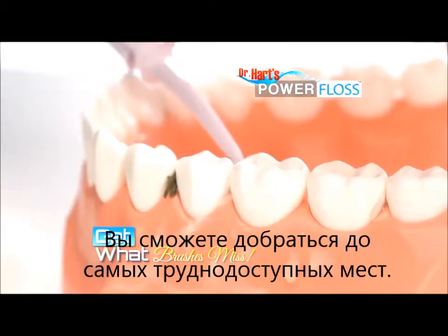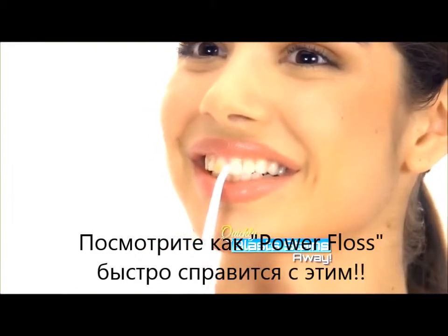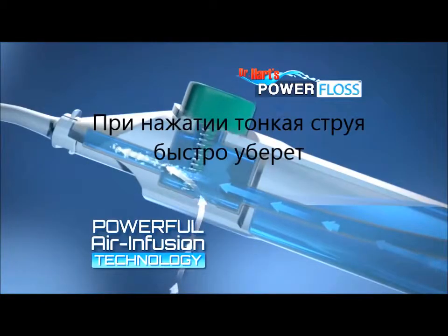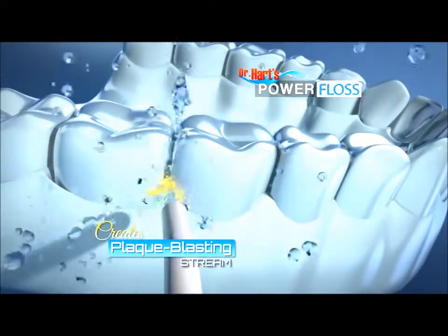Power Floss gets in between teeth to get out what brushes miss. Just watch this. These teeth are covered in coffee stains. Look how Power Floss quickly blasts the stains away, leaving them clean, bright, and beautifully white. The secret is air infusion technology. When you press down, it combines the air and the water inside to create a plaque-blasting stream that helps remove plaque and debris.